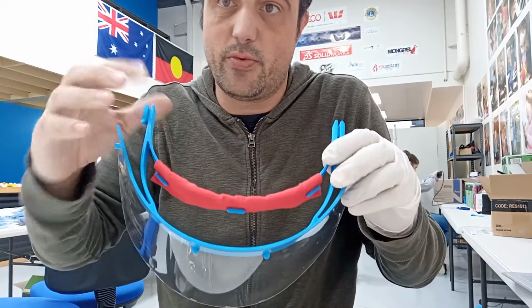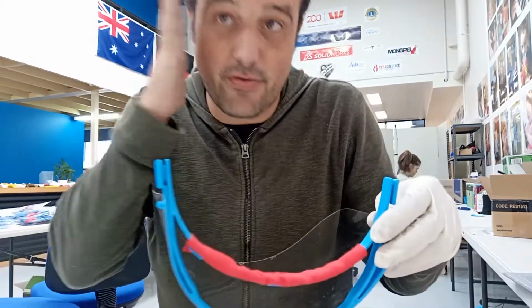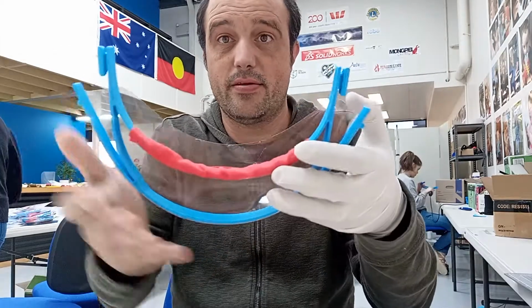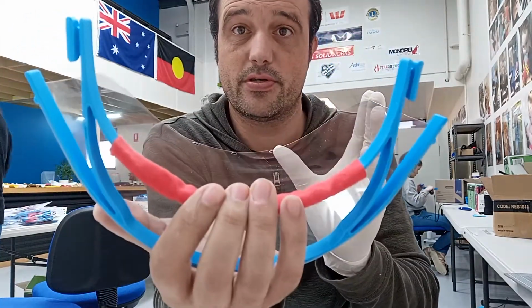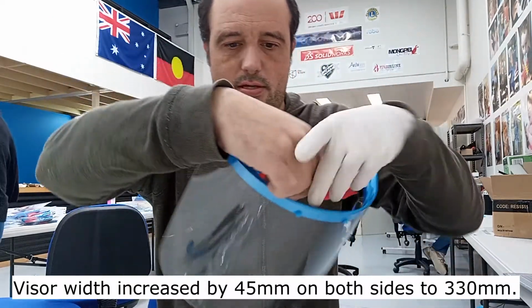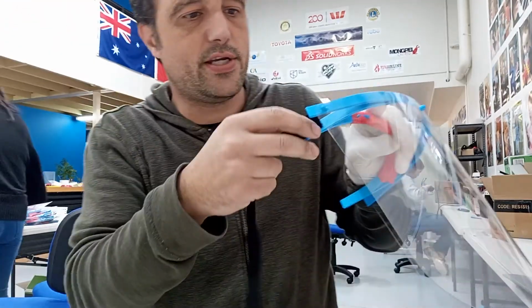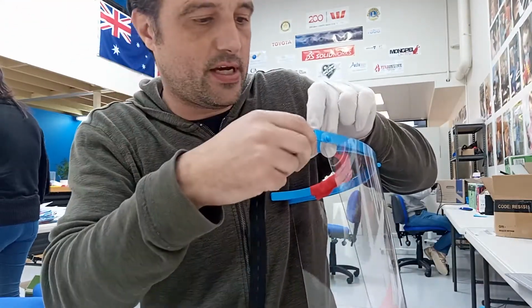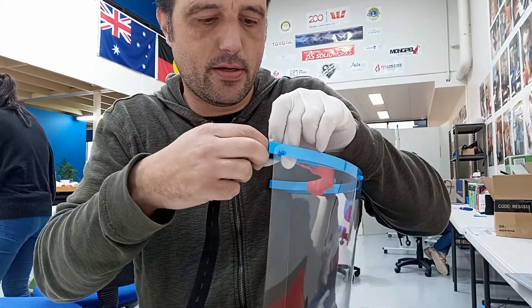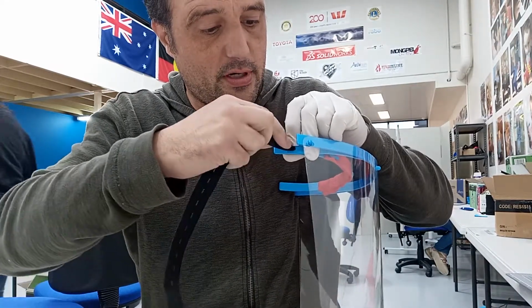And once the elastic's on, we can actually snap these in further. They actually click into place here, so you can get it right up to your face. Our design comes a lot wider than some of the other open source designs to give you that extra level of side protection. So the elastic itself, buttonhole elastic. One side you can just put it on the first hole if you like, and they just mount over these little attachments here. Sometimes they need a little bit of stretching, but they're designed so that they're not going to come off.